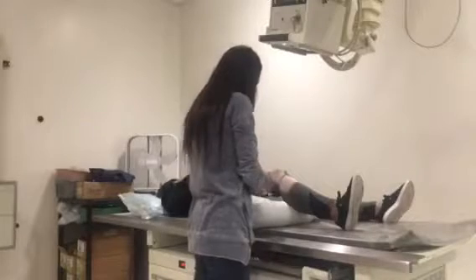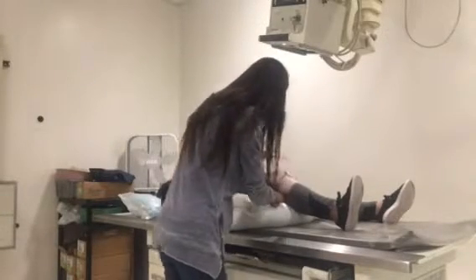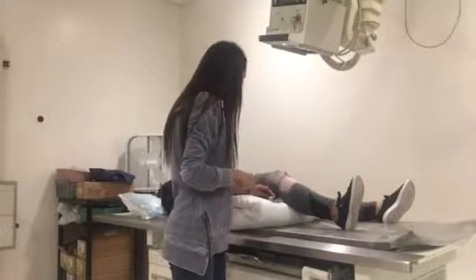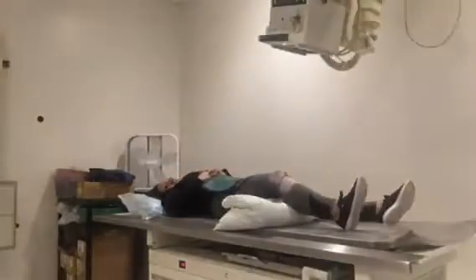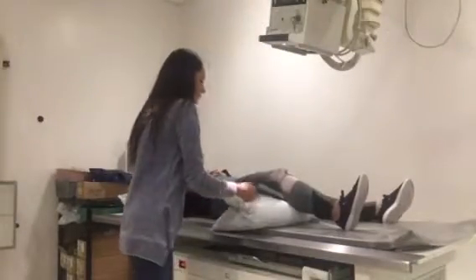I have my right marker. And the technique that I would use for this would be 70 at 5. I'm going to go ahead and take the exposure. X-ray. Come and then go and read my IR.